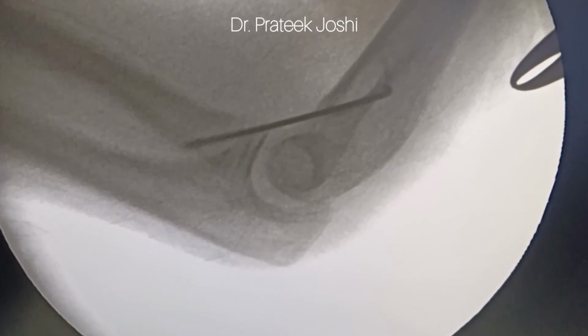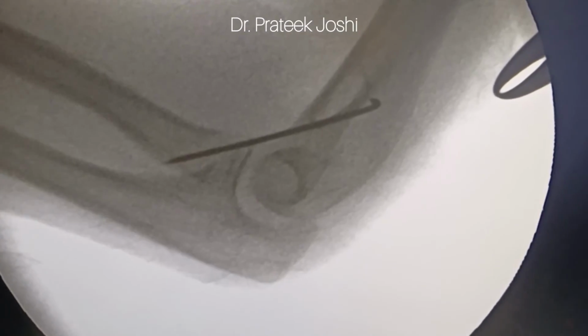We are going to apply an above elbow cast, which with the wire will be removed at 1 month duration.